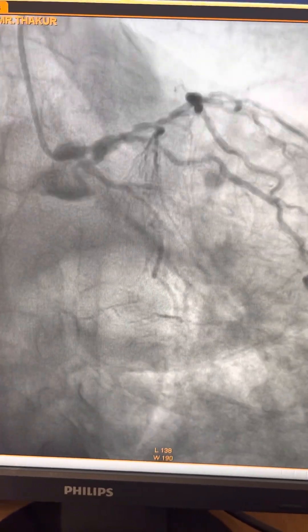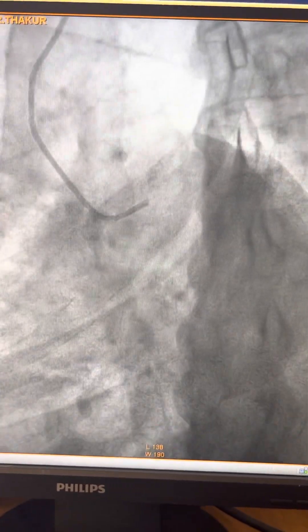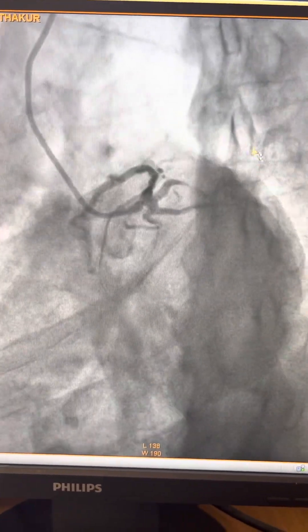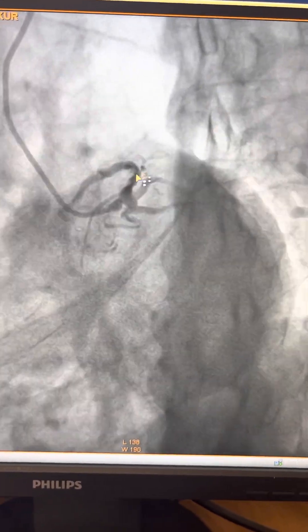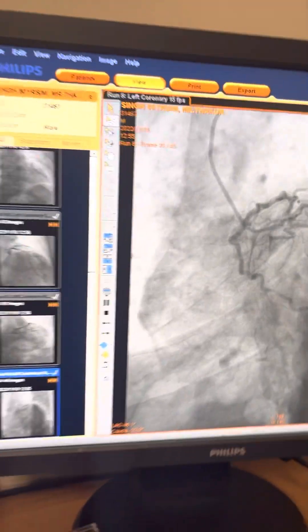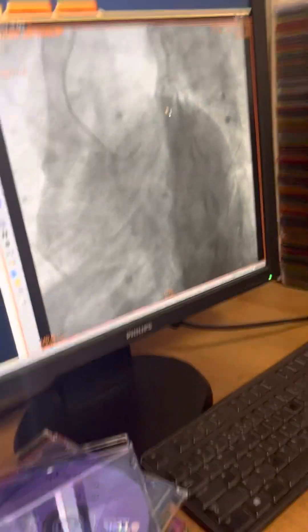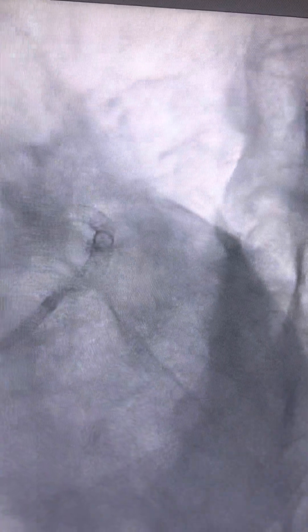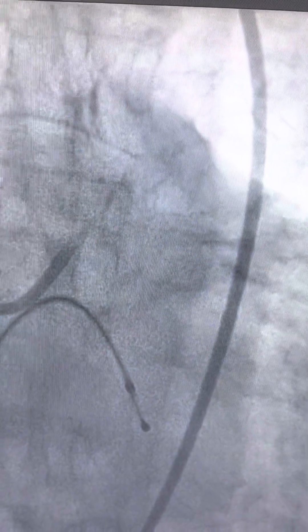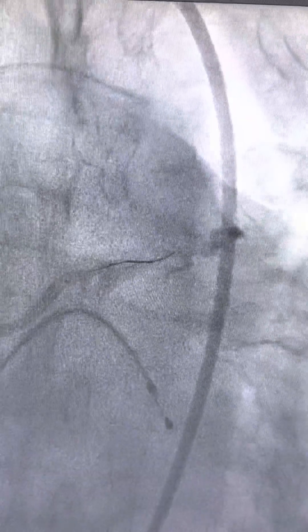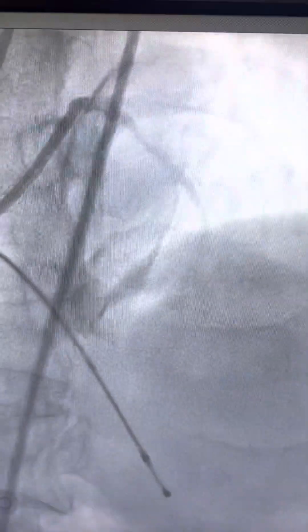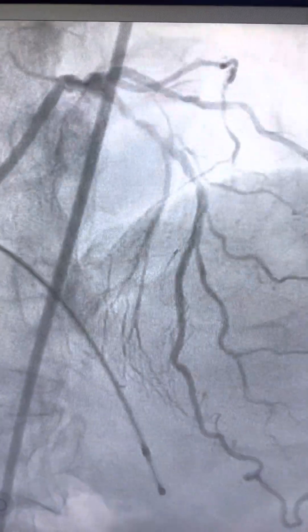You can see in this different view there is a lot of calcium deposit — we can see it here also — and we have gone for rotablation in this case.